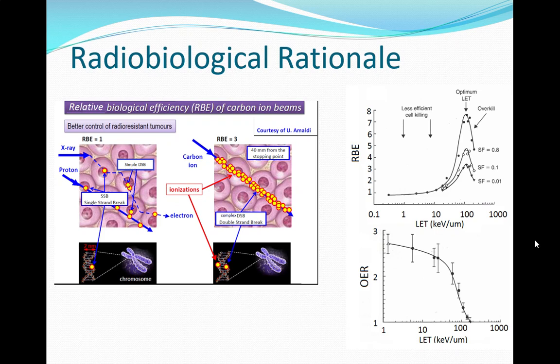And so here's the idea of what's coming in. This is the second reason. The first one is, why do we want PCT? Well, that peak, but if the peak is off, you get a high dose damage that's off, right? If it's centered correctly on the tumor, awesome. If it's missing, there's a part of the tumor that's cold, you didn't get radiation. There's a part of your brain that got hot, got radiation it shouldn't have. So we don't want that.